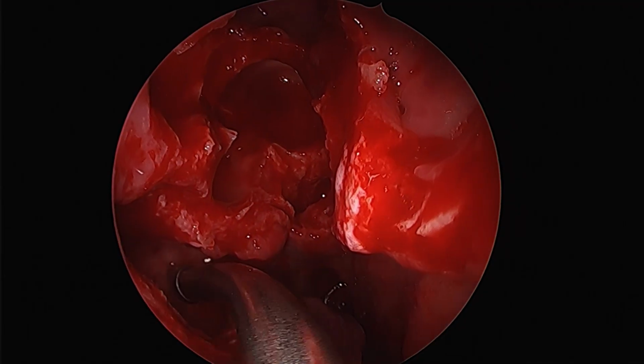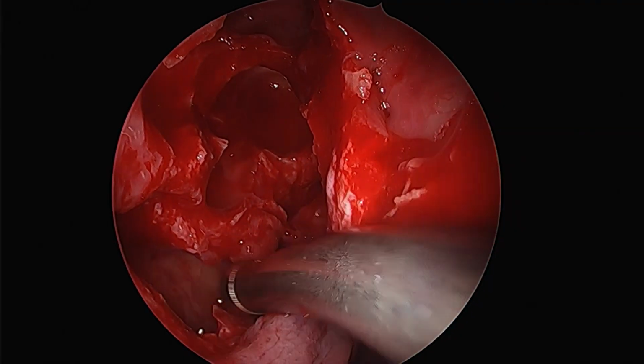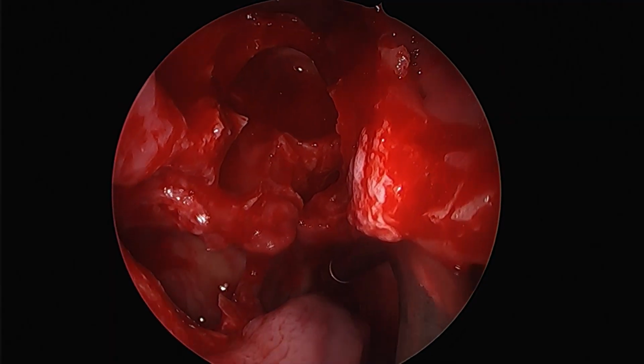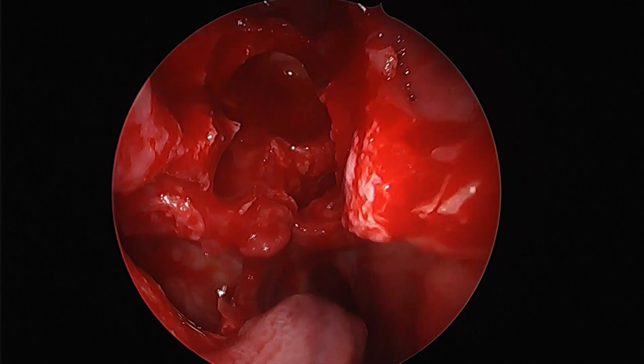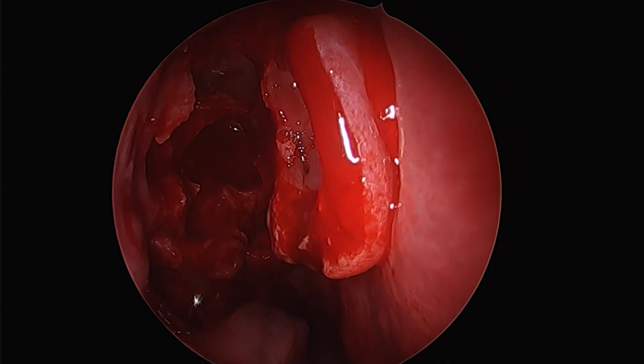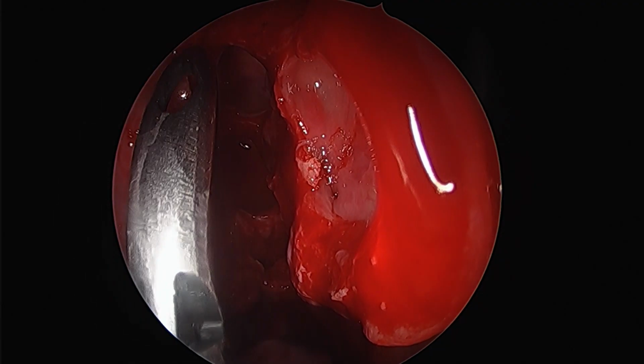Now, what is left is the opening of the sphenoid sinus on this side, because we also saw some kind of soft tissue density inside the sphenoid, which was debatable as to whether it is secretions, fluid from an acute infection, or indeed it could be also a fungal disease as it was in the posterior ethmoids.